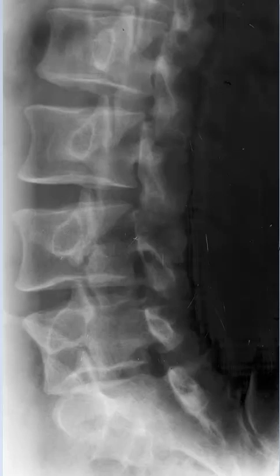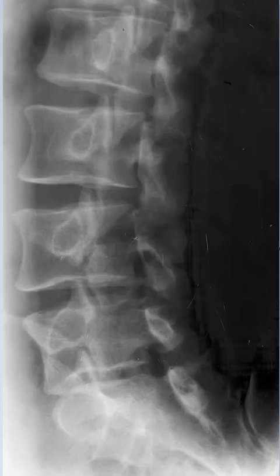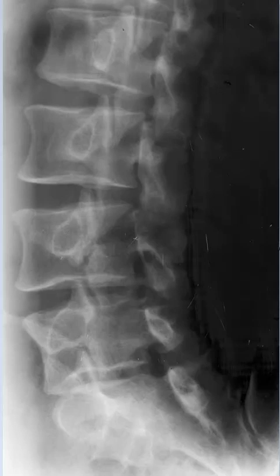Oblique projections are taken with the patient oriented 45 degrees off the bucky. In the lumbar spine we do not need a tube tilt whatsoever. Remember that obliques in the lumbar spine are very different than obliques in the cervical spine, both in the orientation of the tube as well as the purpose.